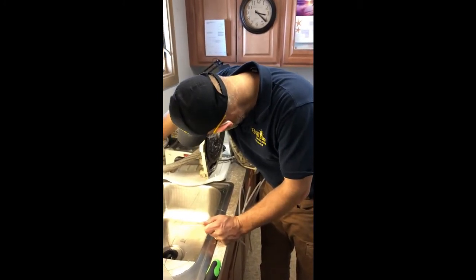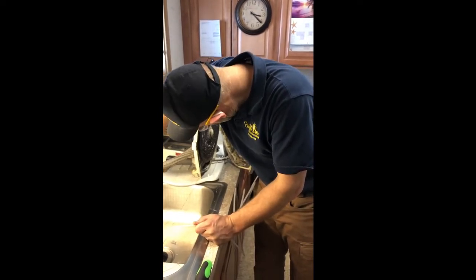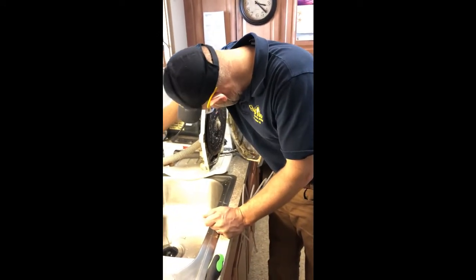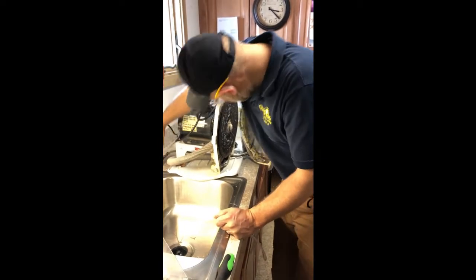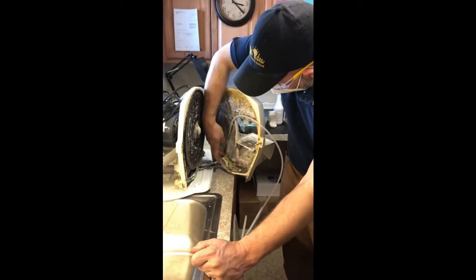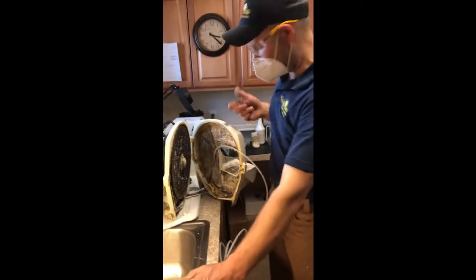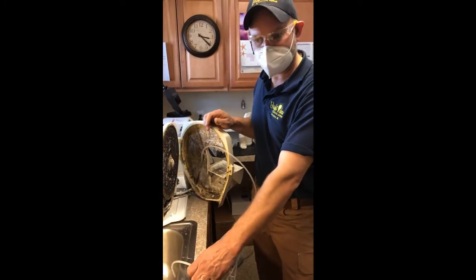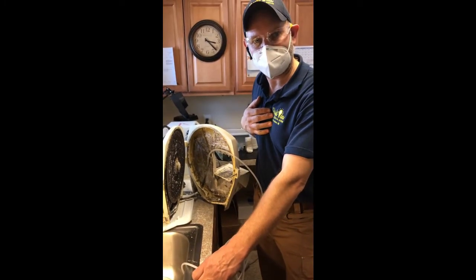Yes, you should start it on the top and then run to the bottom. All right, that's interesting. It looks like we're getting some water coming out here. We might have to spend a little bit more time trying to clear the blockage in here. But essentially, this is the technique that we used, cutting off the top, and when we're done, we'll pinch it all back together, and then we'll give one final look at what it looks like when it's all finished.